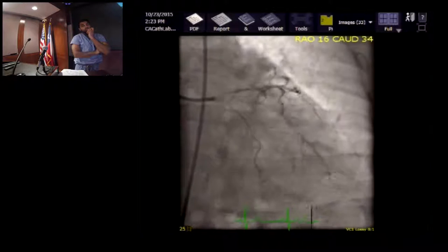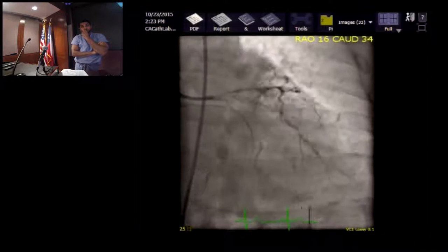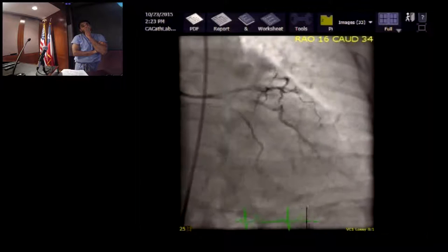So the ideal way would have been to actually go back in with an FFR wire, if you're wondering whether the LAD ostium was significant. You're wondering about the distal lesion, right? No, there's LAD ostial disease, then there is a mid LAD disease, and there's a diagonal disease. Okay, so you don't have sequential lesions other than the ostial LAD disease. So once you've established the ostial LAD disease is 50% at the worst, based upon the IVUS data.